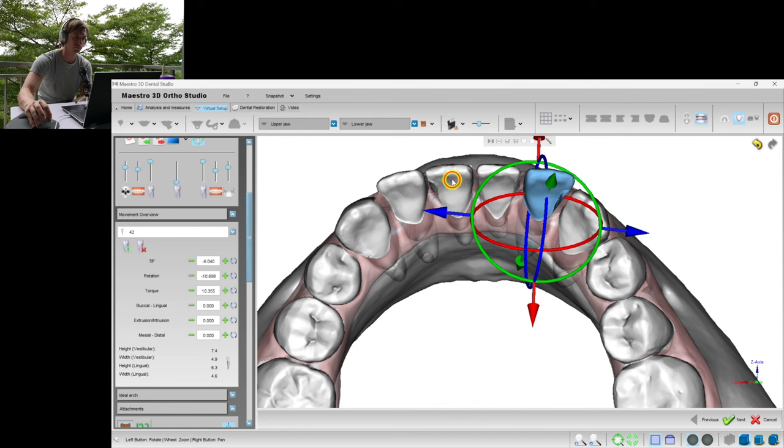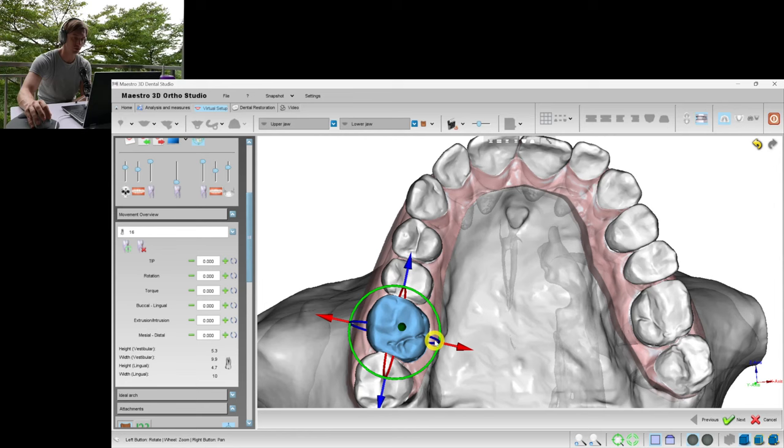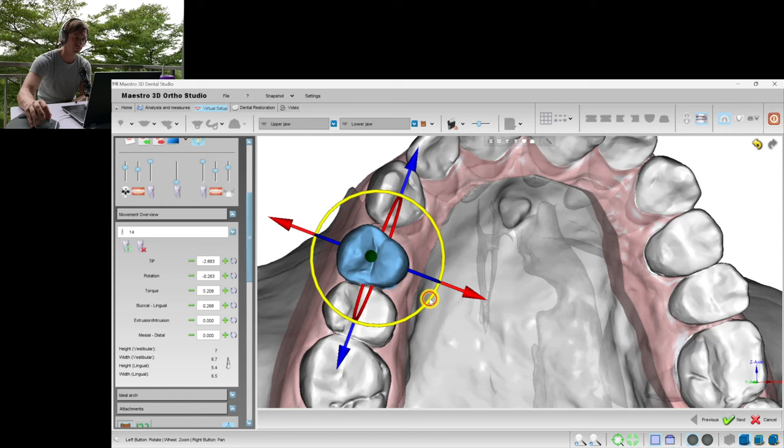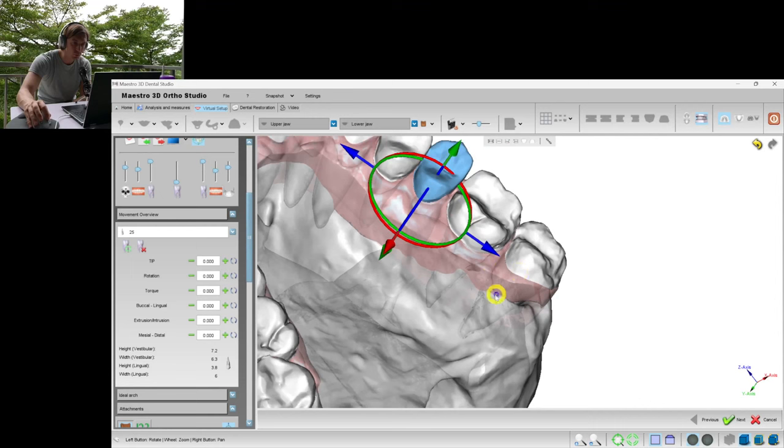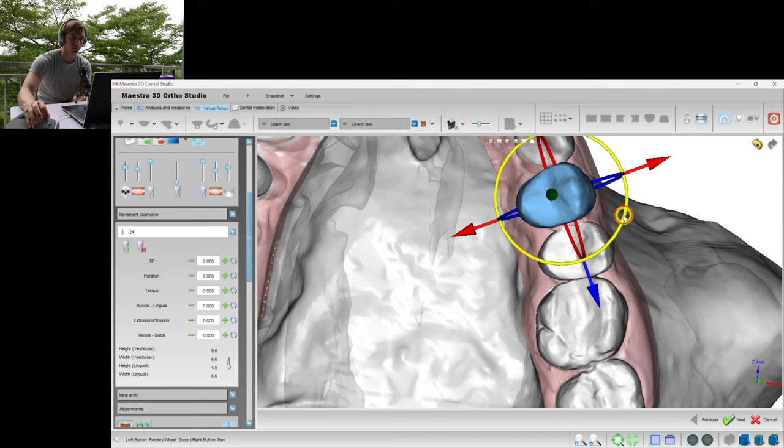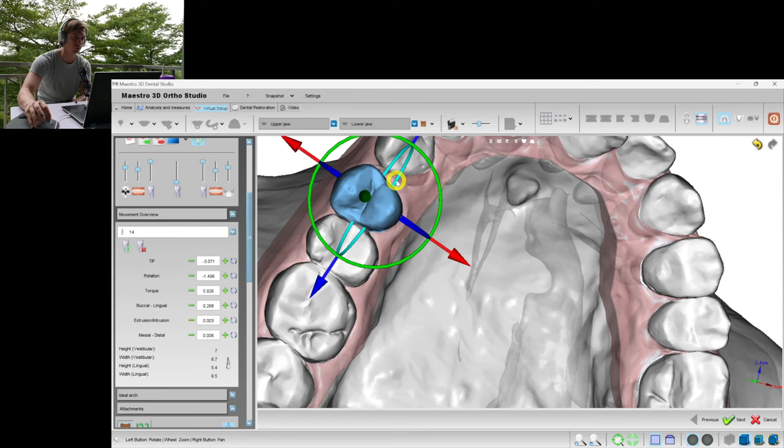Now let's go to the upper jaw and do the same. We will make some expansion of the first molars, of the premolars. I combined the tipping movement and the translational. We can move not more than two teeth distally at the same time, so that we always have to have an anchorage.